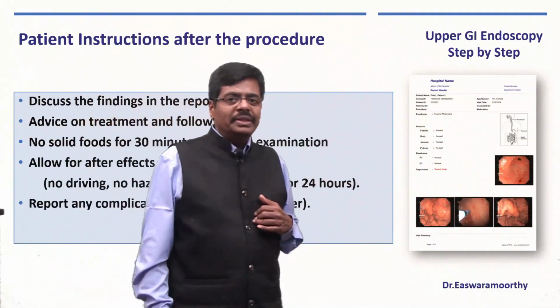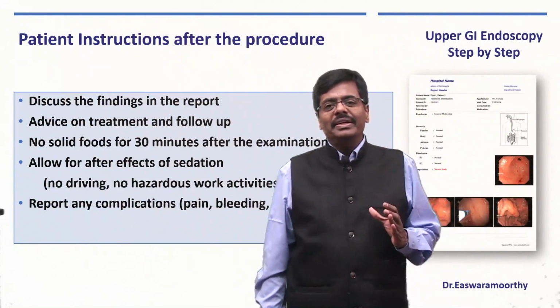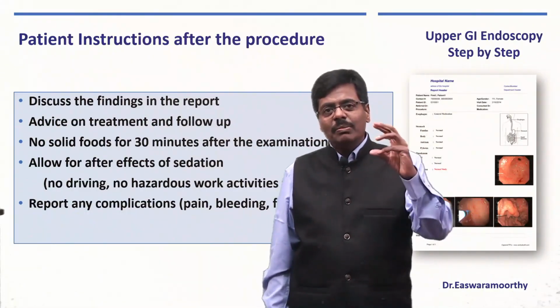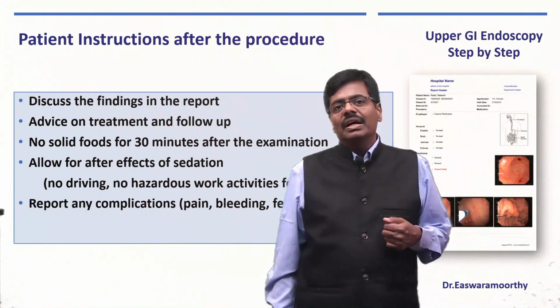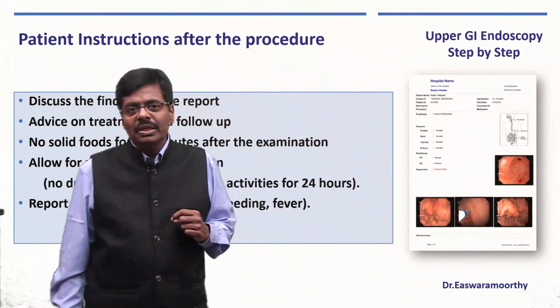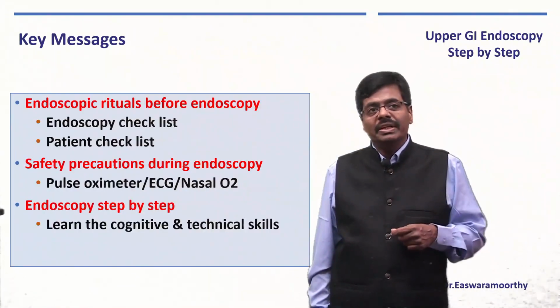And once you have successfully completed the procedure, it is not over there. You need to have a detailed report like what we have given here. So you need to have a software where you can record all the findings and use the standard definitions and all the internationally accepted terminologies to describe the lesions, have some pictures annotated and give it to the patient or the relatives, and give the detailed diagnosis and treatment plan, and also tell them, especially when they are sedated, not to have any solid food for 30 minutes, not to drive for the next 24 hours. All these instructions have to be given, and also a contact number to contact you in case of any difficulty.